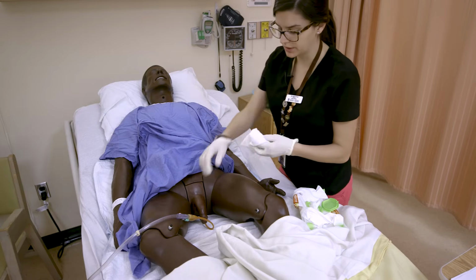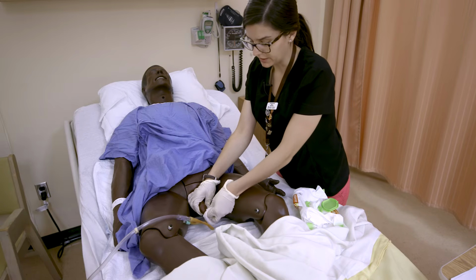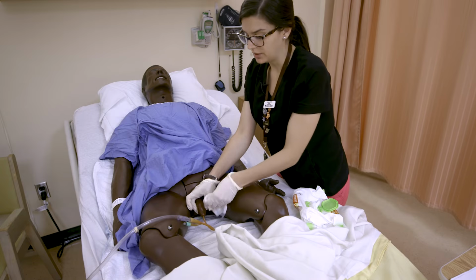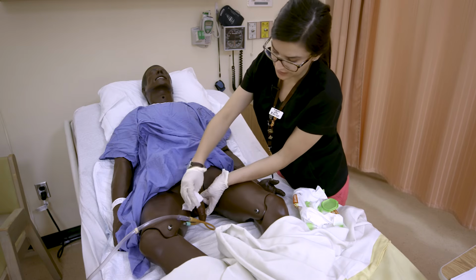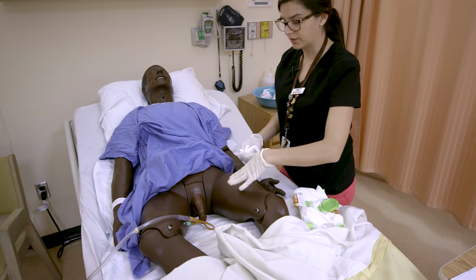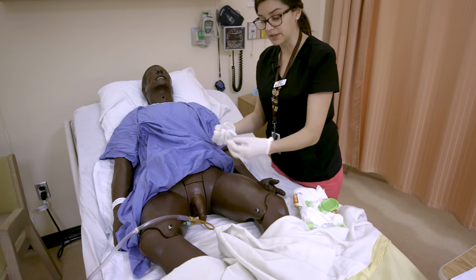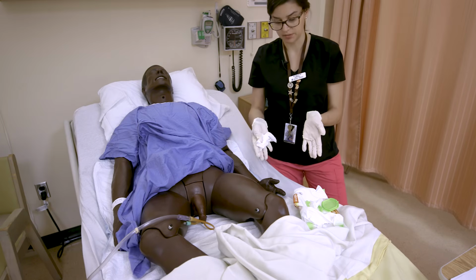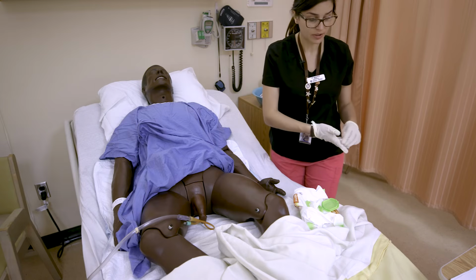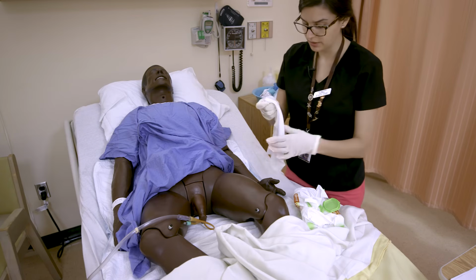So we're going to, again, just like with peri-care, start at the urethral meatus and go around. And we're going to clean the tip of the penis and then down. Especially you want to be careful if there is stool contaminants on there, that you're not getting them on your gloves and then sort of spreading them around. So if your gloves do become contaminated, you're going to want to throw them out and get new ones. So we'll just throw this in the garbage and get a new one.